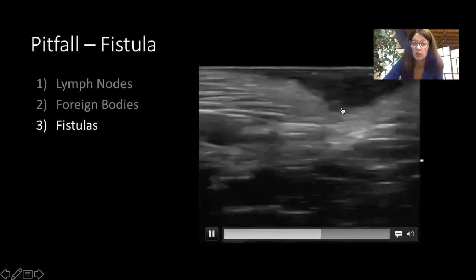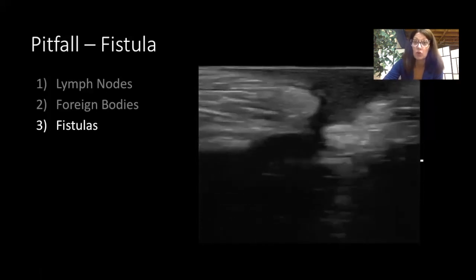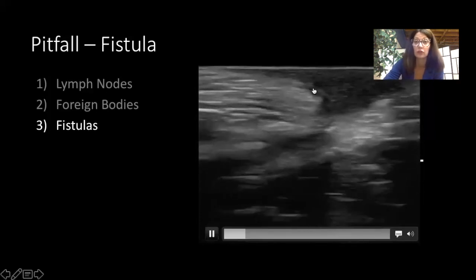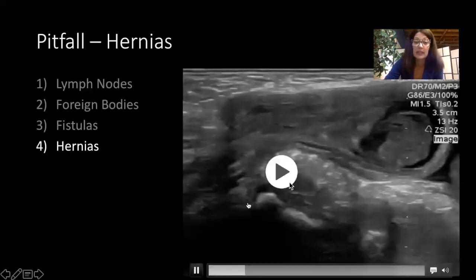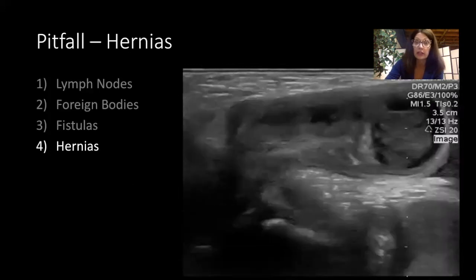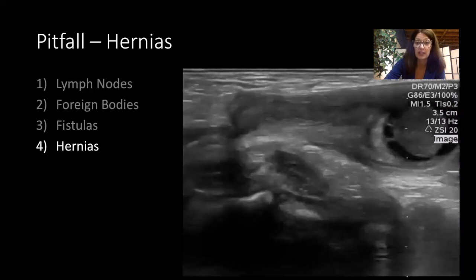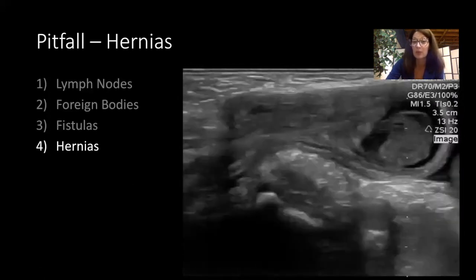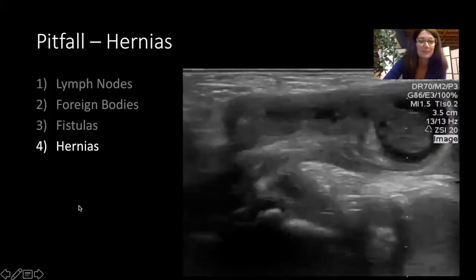So in this case, general surgery was consulted, and then the child had a CT. And this would not be one that's appropriate for drainage in the ED. Finally, in the periumbilical or inguinal area, you may be surprised to find that there's actually a hernia there, and it's not cellulitis or an abscess. And this is what a typical inguinal hernia would look like. You obviously wouldn't want to go and I&D that.